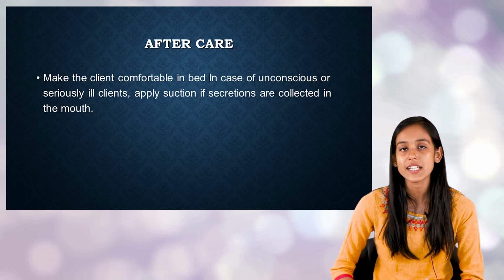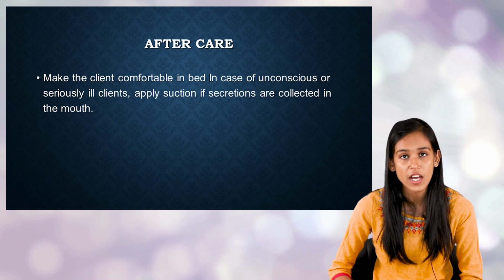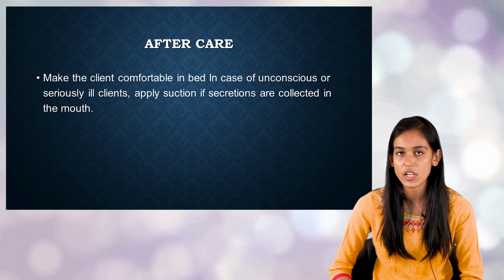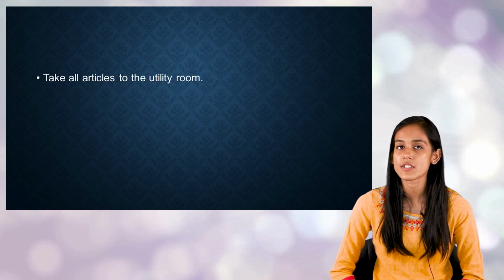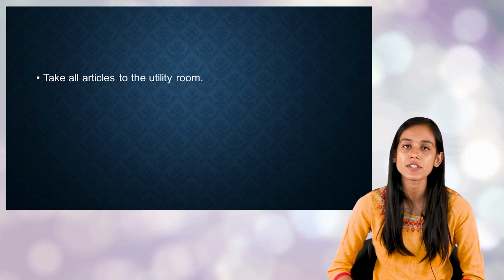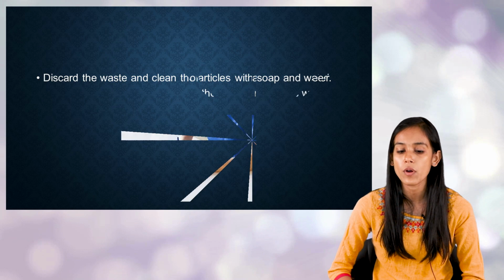If the patient is seriously ill, or unconscious, or if there are any secretions collected in the mouth, in that case you can provide suction, and then you can take all the articles back to the utility room, and discard whatever waste products you got.